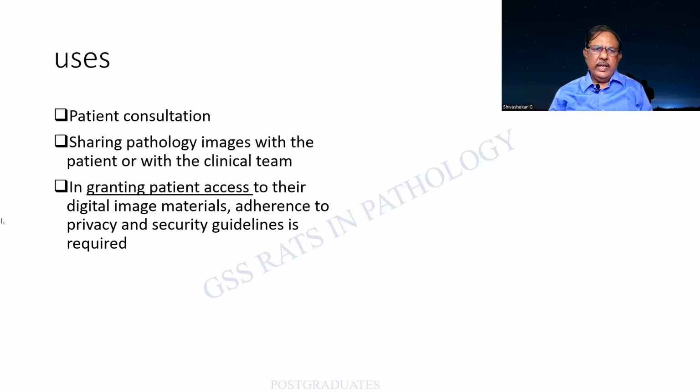The various uses include even patient consultation. This is a factor we have not been aware of. Sometimes when you want to get consent and other things from a patient, this can be used. Sharing pathology images, and also giving the patient access. Nowadays we are giving duplicate slides, but this can be done by means of the imaging itself.